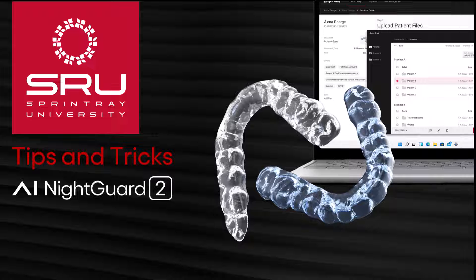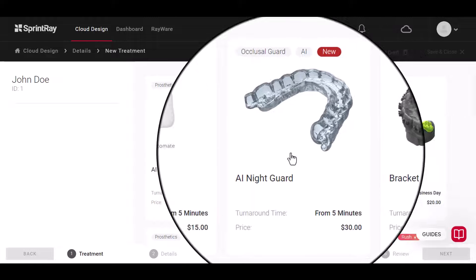In today's tips and tricks video, we will showcase how to use the new AI Nightguard 2.0. Are you ready to get a nightguard design in minutes?